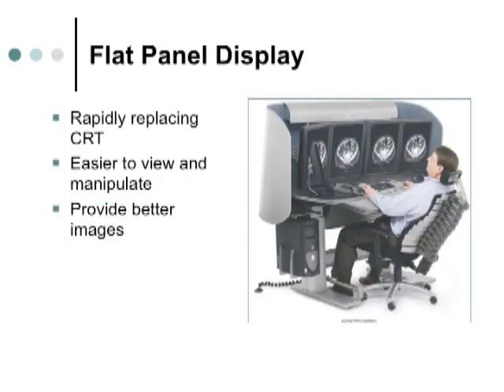Okay, the other thing that's changed with the system now is that we're no longer using cathode ray tubes as our monitors. They're using flat panel display monitors. How many of you have flat panel display monitors on your computers now as opposed to the big TV monitors? How many of you have flat panel television monitors? Okay. There's a little bit more outlay initially as far as the cost goes, but overall the footprint of these images fits better on these. They're easier to view and manipulate. All radiologists now that are reading digital images have these monitors in their office. The old multi-loaded view boxes that we had with the hundreds of panels have pretty much gone by the wayside.